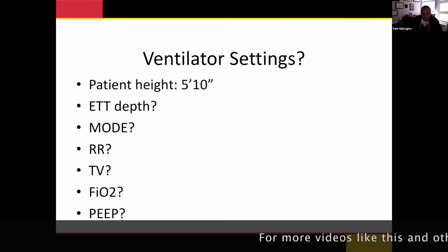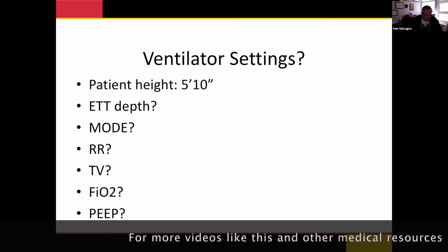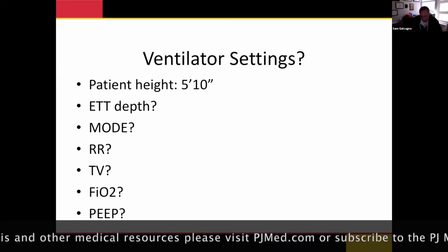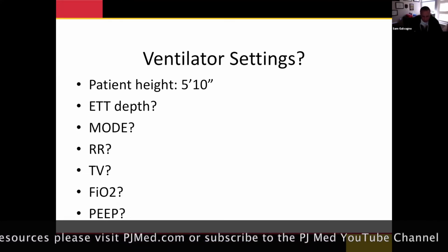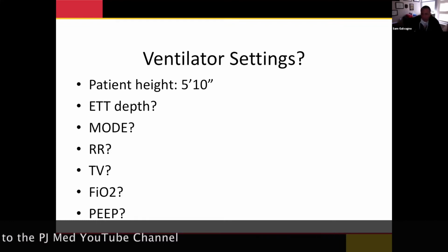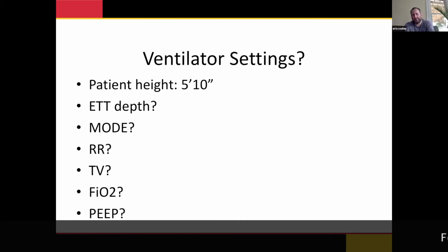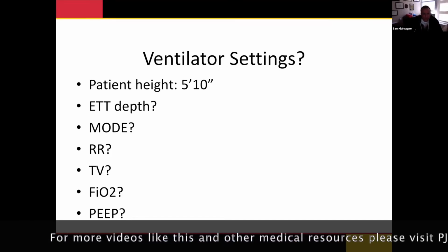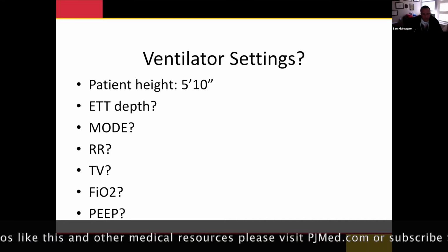Yeah. What about your mode? What do you want to choose for mode, guys? Assist control, pressure regulated volume control, pressure control, SIMV. And I'm not going to argue there's one right answer. I just want to hear, what do you think? Assist control. Okay. So we talked a lot about that, right? That's not a bad place to start. It's a basic mode.